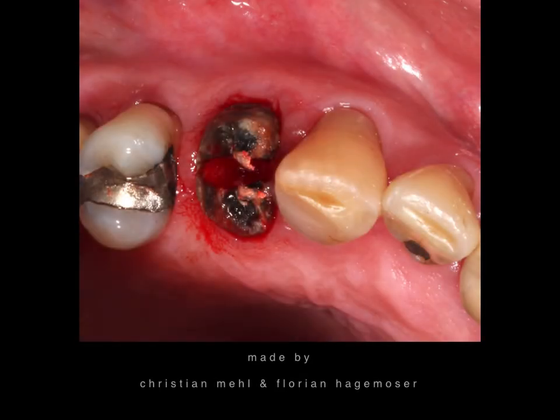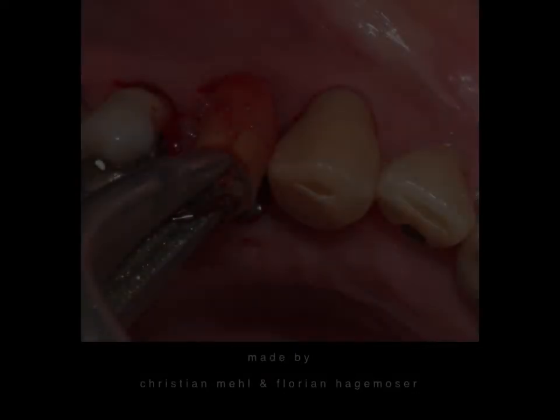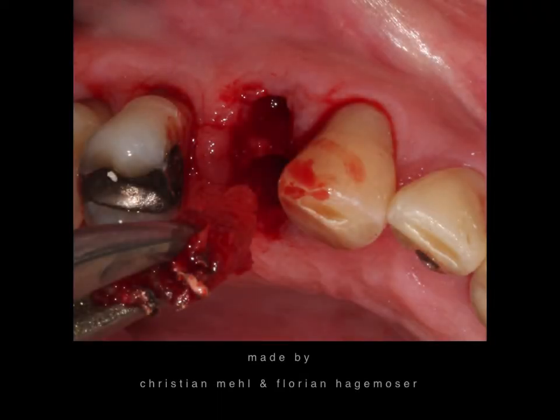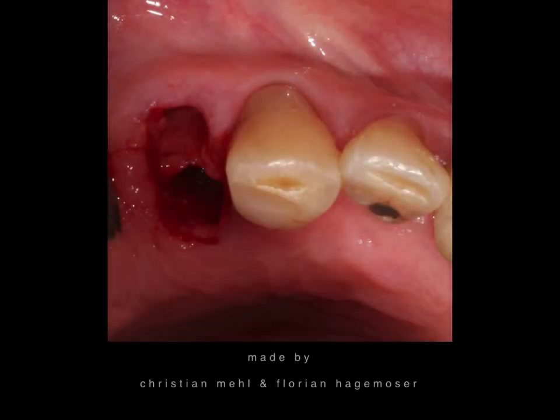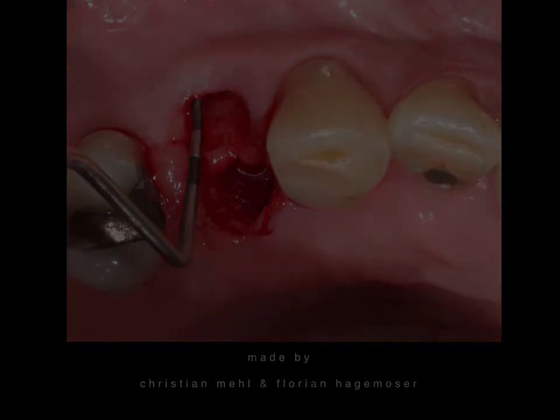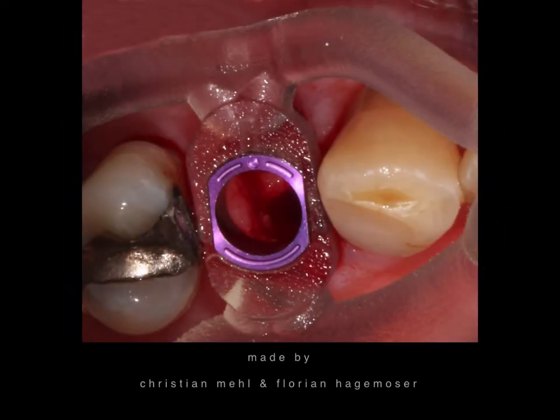So we're prepared now and the surgery can start. The surgery took something around 27 or 28 minutes. We began with injection and local anesthesia, then cut the roots — took out the buccal root first, then the palatal root. We checked for any apical infection, which in this case there wasn't any. We left the anatomy intact and checked the buccal bone lamella. If it's intact you don't need to lift a flap, which we didn't need to do here. Then you just place the guide and drill away.